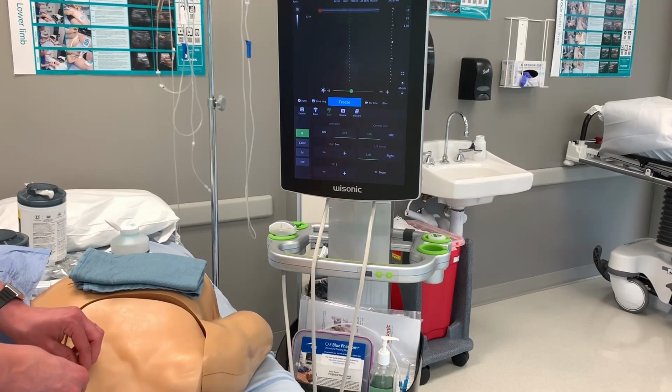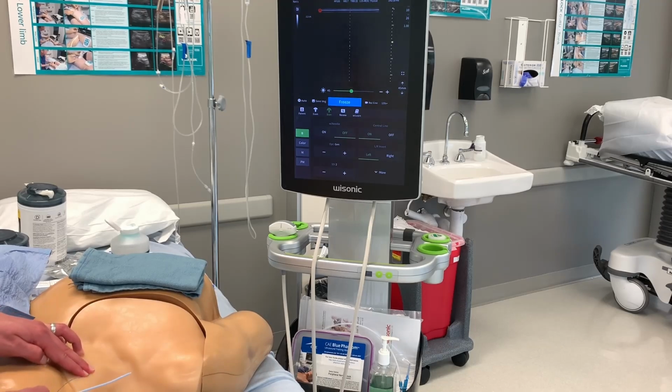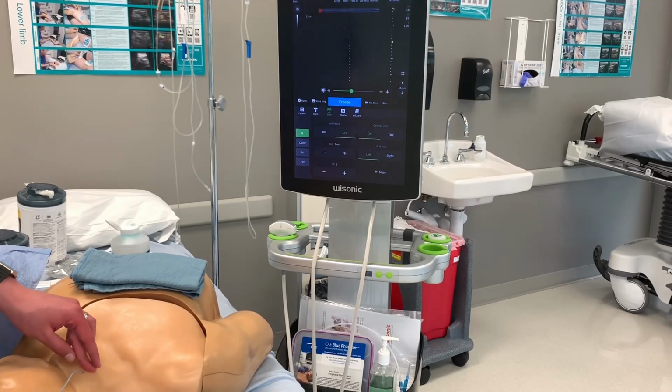Now it's time to remove the dilator while maintaining the guide wire within the vessel. Otherwise, we have to repeat this entire process again. Now it's time for the actual central venous catheter. Thread it over the guide wire. It's important to not insert it until you have control of the guide wire so that you don't just send the guide wire into the heart. That can happen.